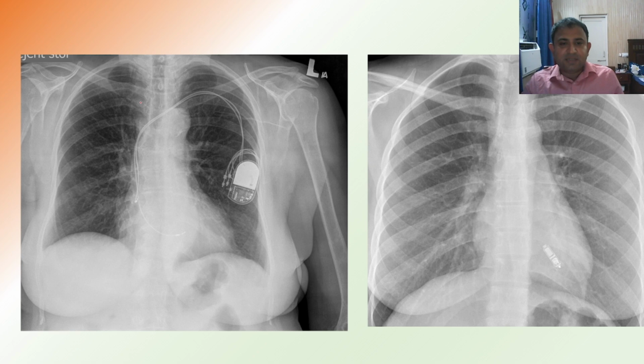So what are the latest advances in pacemaking? What we see over here is a dual chamber pacemaker. This is the atrial lead lying in the right atrium, which senses, and then there is an RV lead which paces the heart. So what is this structure that you see over here? This is a miracle of modern medicine. This device is known as the Micra.